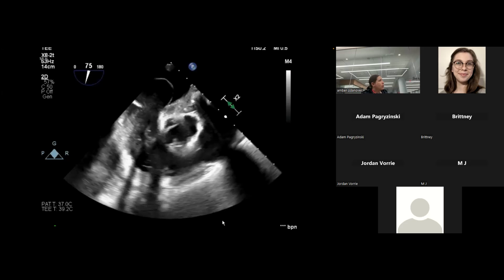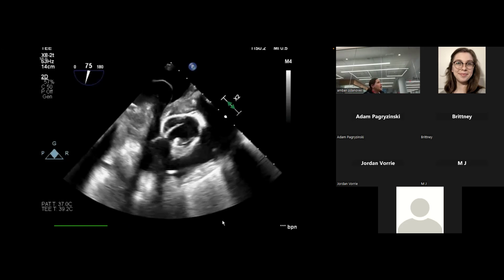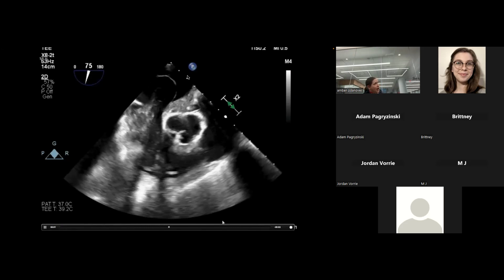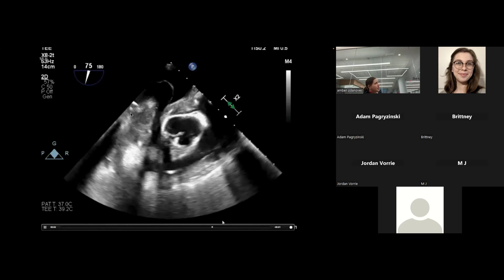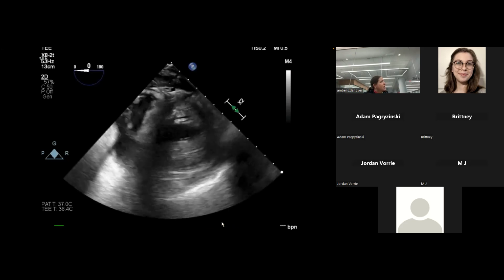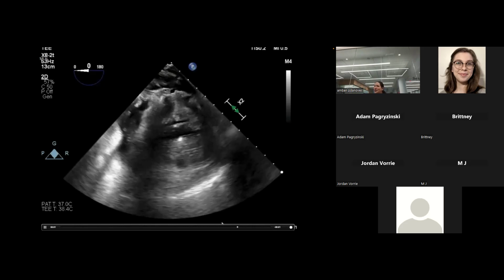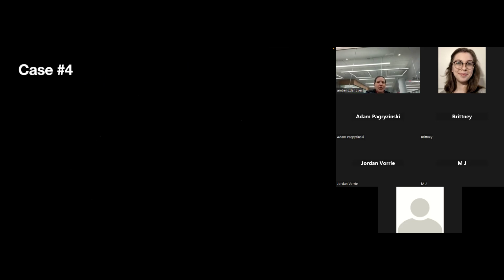And now what view are we probably looking at here? Remember, everything's going to be a little distorted. Yeah, so RV inflow, outflow. You know this is your aortic valve here, and probably what this is based on the last picture: that's your interatrial septum bowing way to the left. And what would that right here be? You can kind of see it. Tricuspid. And then what is all this? Clot. And if you look down in the mid-pap view, you can see your EF's almost 100%, right? That's just because no blood's getting over to that. Exactly.